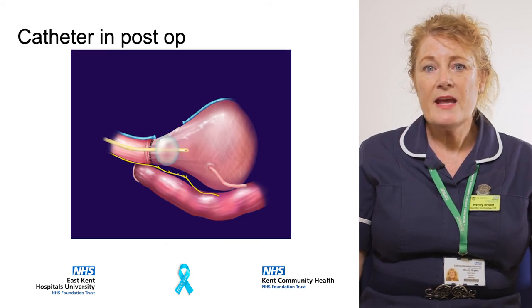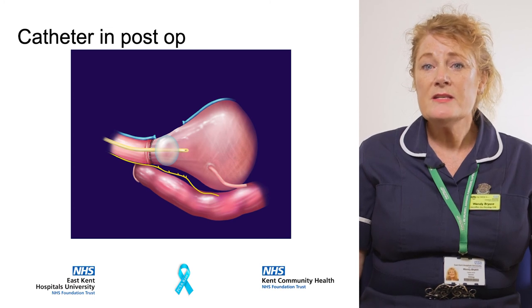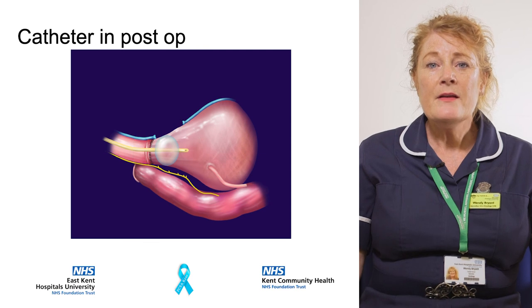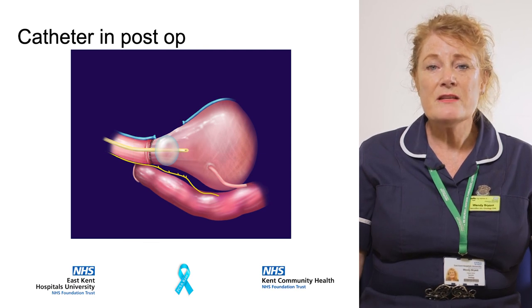This is a picture of the catheter in place. You will notice the catheter is held in place by an inflated balloon. The catheter is inserted during the surgery.